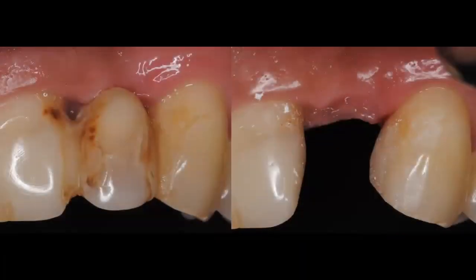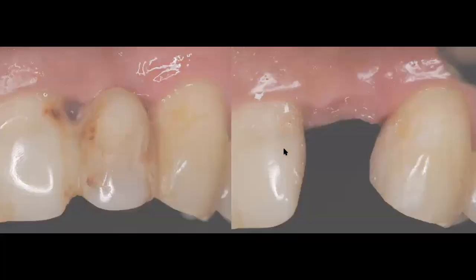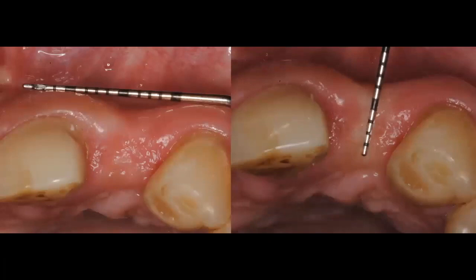So the first thing that we did for this patient obviously was to remove that temporary bonded prosthesis and remove all the excess resin that was used to bond to the neighboring teeth. And then we're just going to start evaluating the case. And, as we all know, there's a couple of things that we need to evaluate when we are having a patient, and we're going to make a decision based on can we or can we not place an implant for this patient to restore that site.